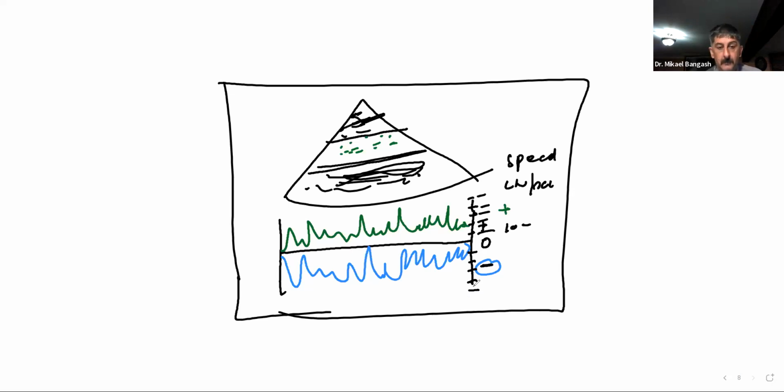centimeters. Now, some systems may even give you other values over here, which are just your frequencies in hertz, or kilohertz or whatever.